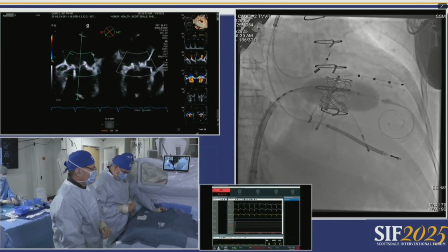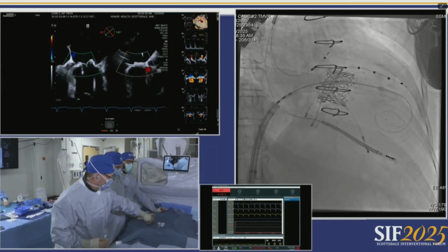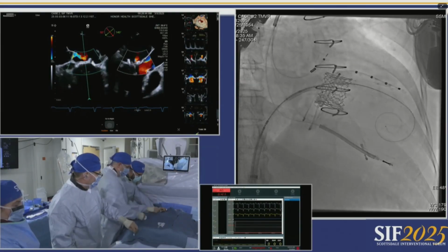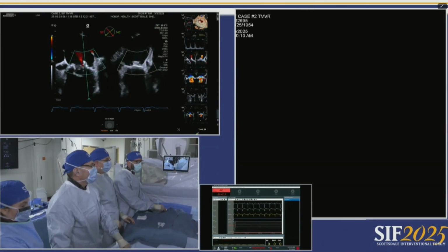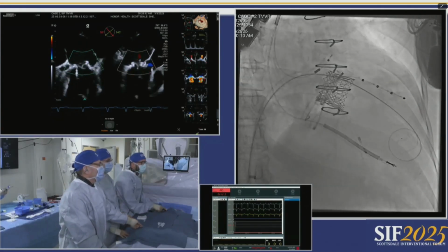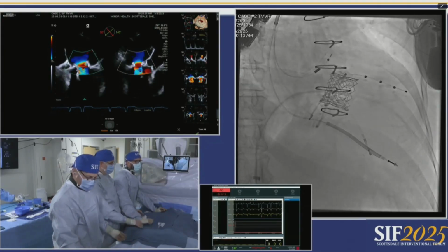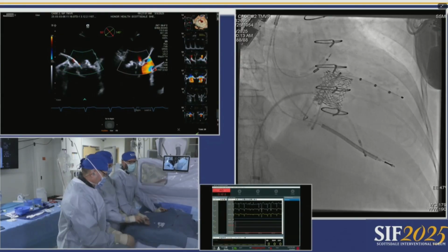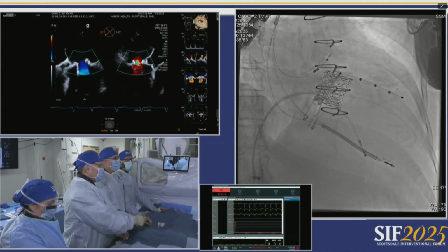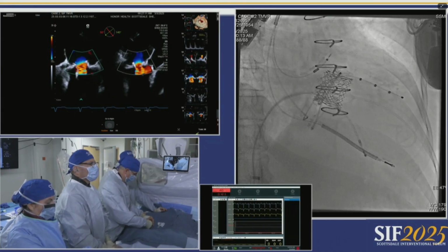While they're making the switch, does everyone on the panel still pace for mitrals? I stopped pacing a while ago. If you need to pace, it's because you think you need to stabilize the annulus on your screen. But in actuality, what I was finding was the rapid pace was freezing me in systole, and in some people there wasn't enough room for the balloon in the ventricle, and it was creating canting. When I just let the patient stay in diastole, I was getting better coaxiality with the valve, particularly for valve and ring. So I stopped pacing for the mitrals. Try it. You might like it. Adam, now you tell me.